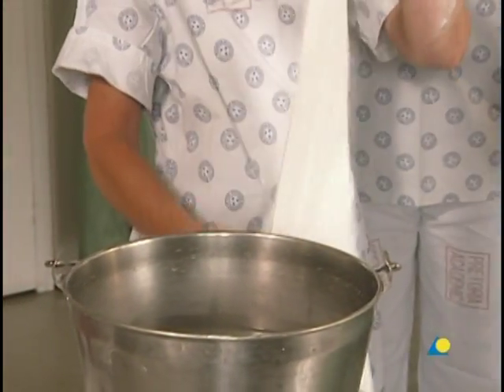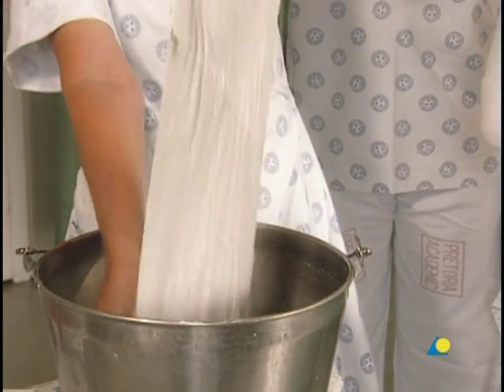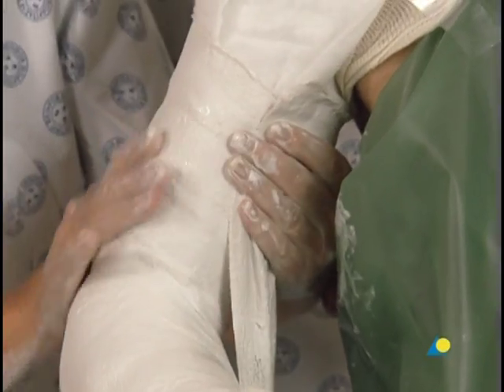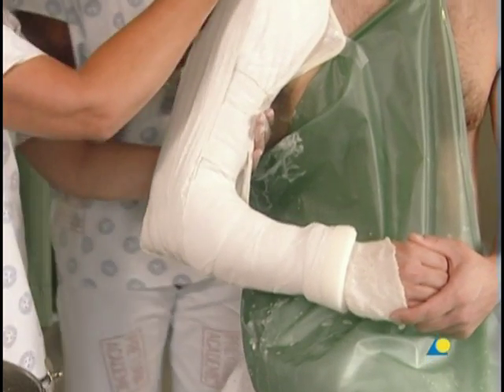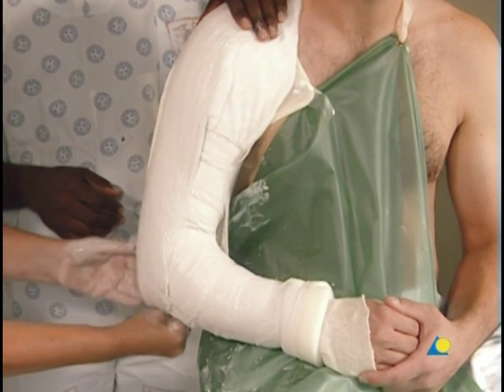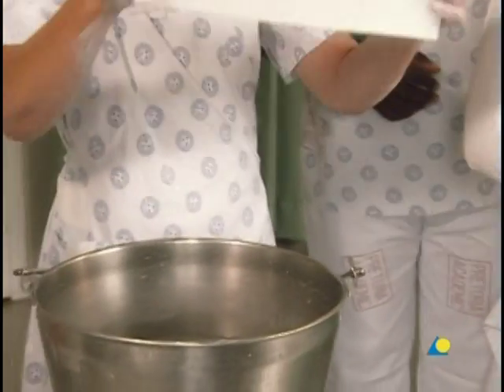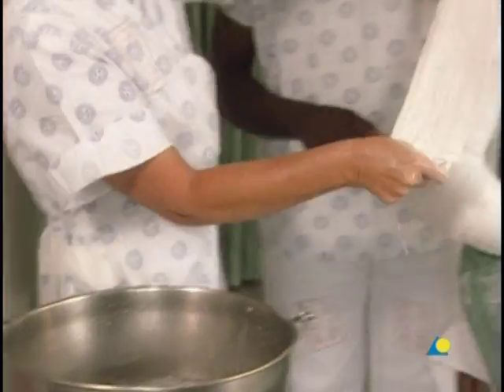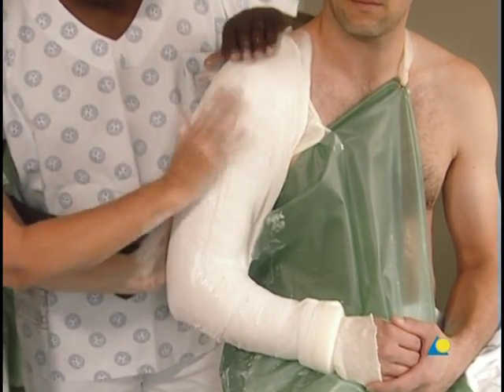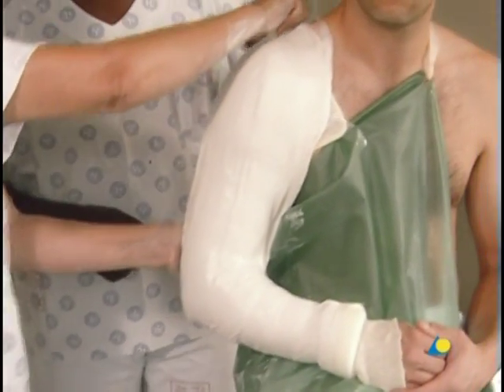The first plaster slab, 125 millimeters wide, is wettened and the excess water is removed. Beginning at the axilla, the slab is passed around the elbow and over the shoulder, forming a U. The flap at the elbow is smoothed down to provide extra strength. A second slab, 100 millimeters wide, cut in two parts, is applied both to the front and back, forming a second U.